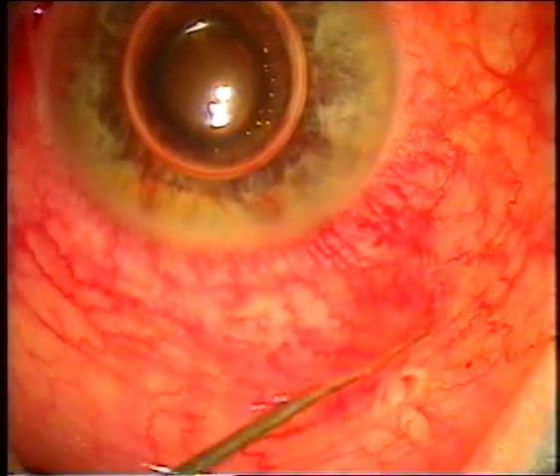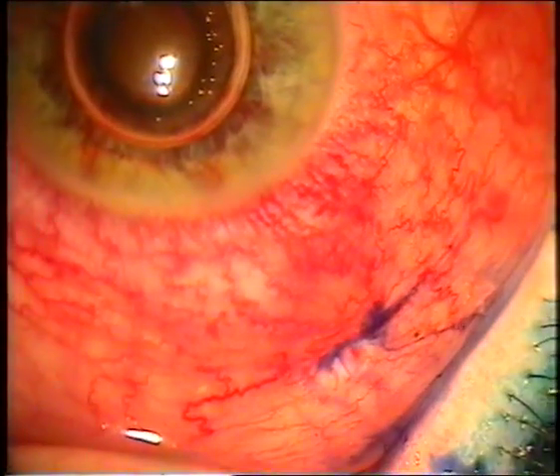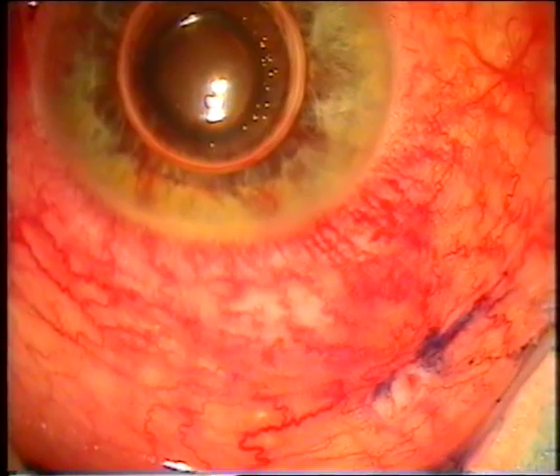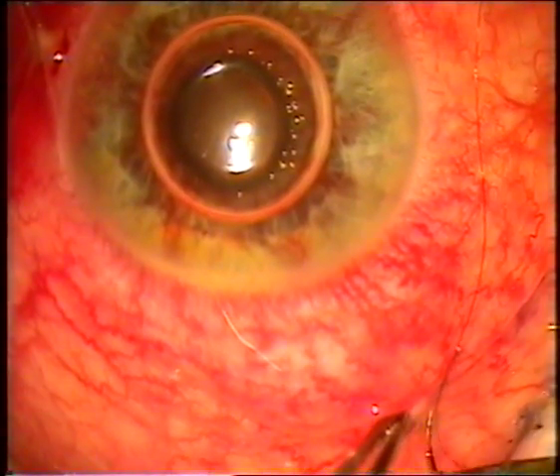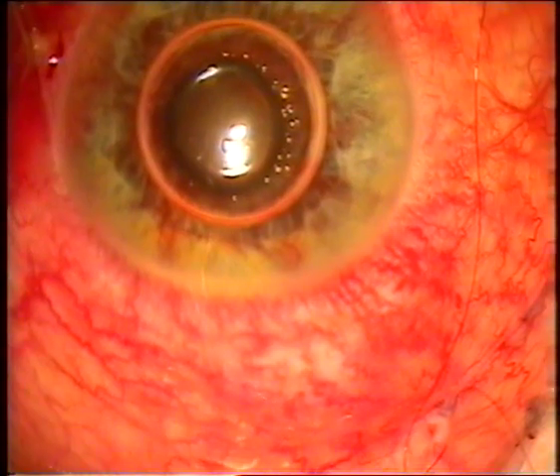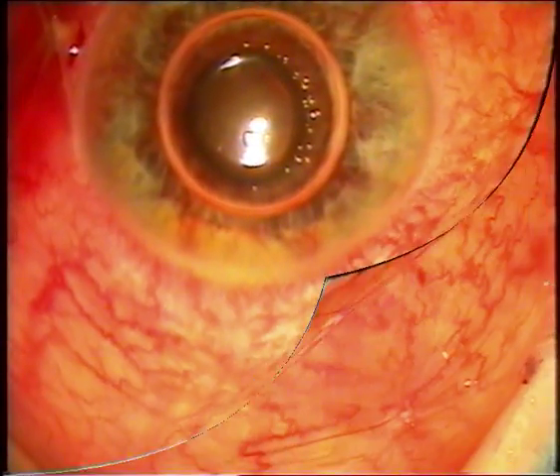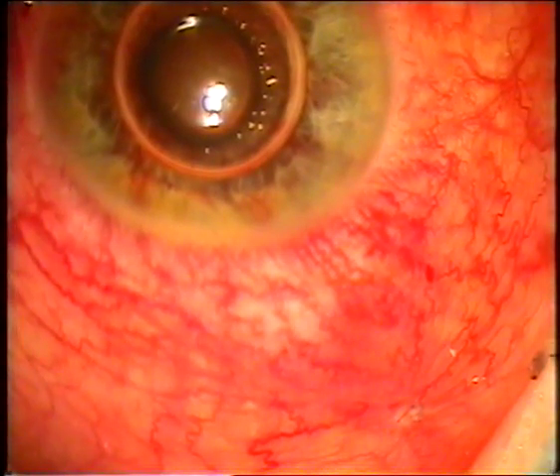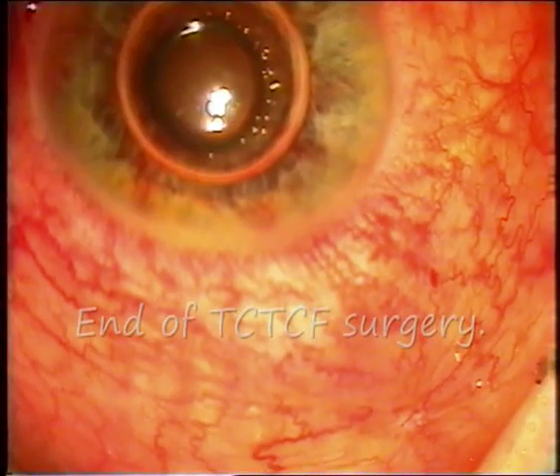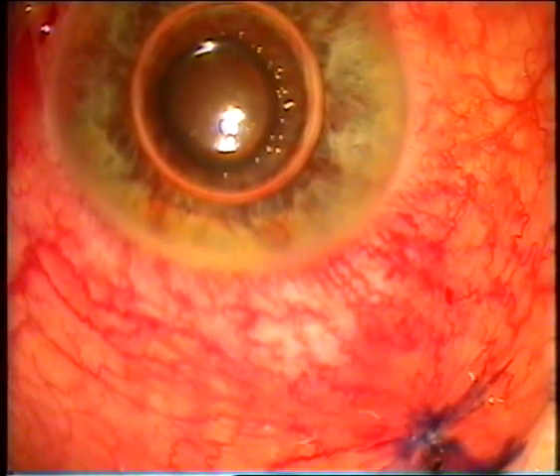The air bubble should come from behind the iris into the anterior chamber, confirming that we are in the posterior chamber. We verify the filtration with one drop of trypan blue and put a single 10-0 nylon suture on this opening. It is cut and we again verify any leakage of fluid from this site.